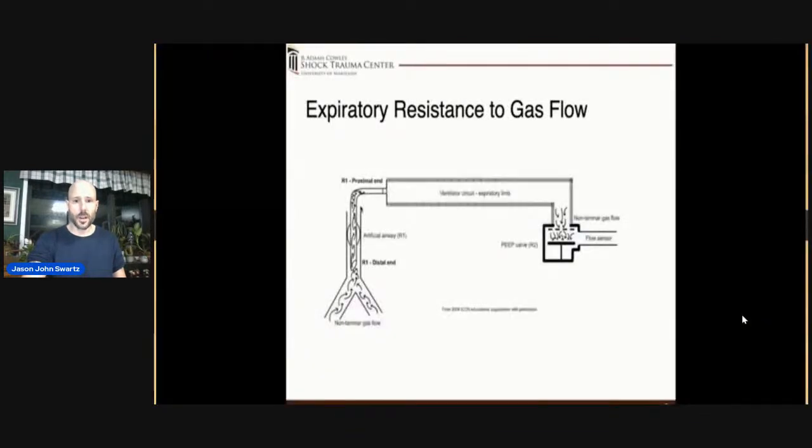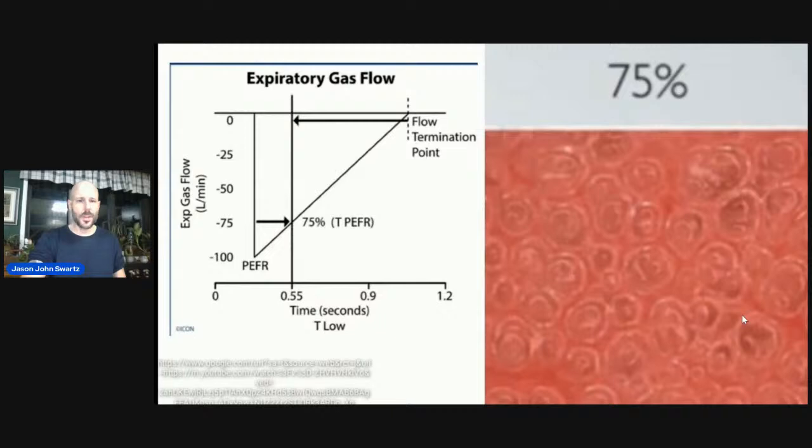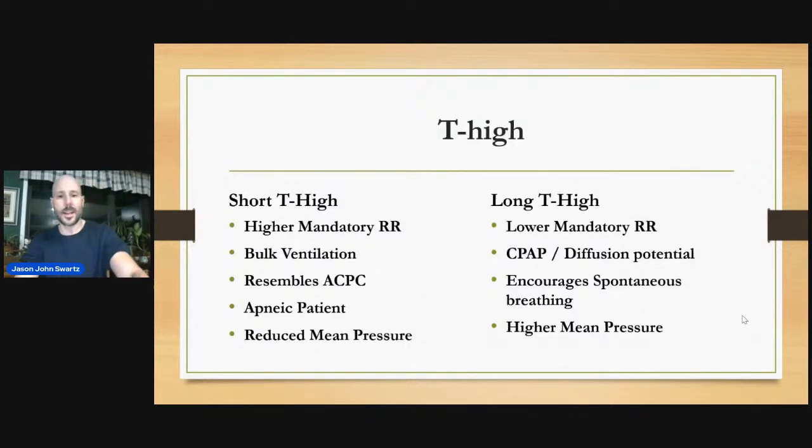The typical lung only moves, is it 10%? It's such a small change between inspiration and expiration in the lungs, like the way we're breathing. Let me get out of here.